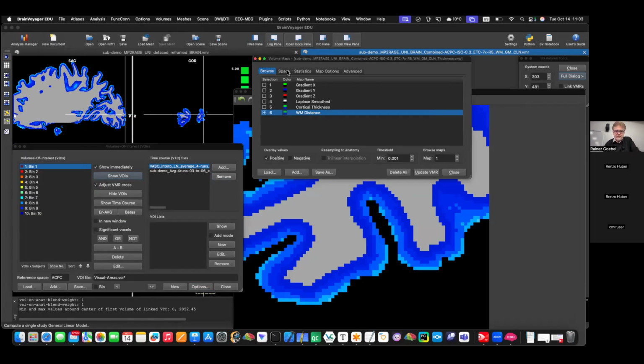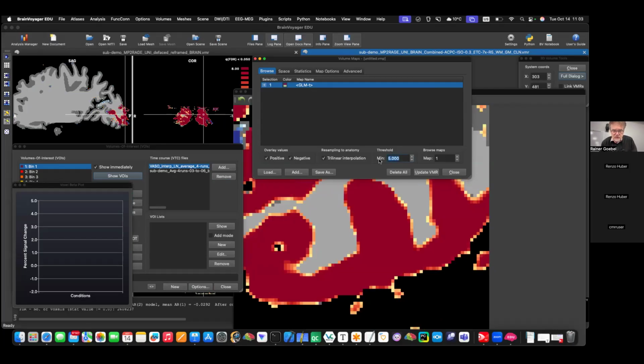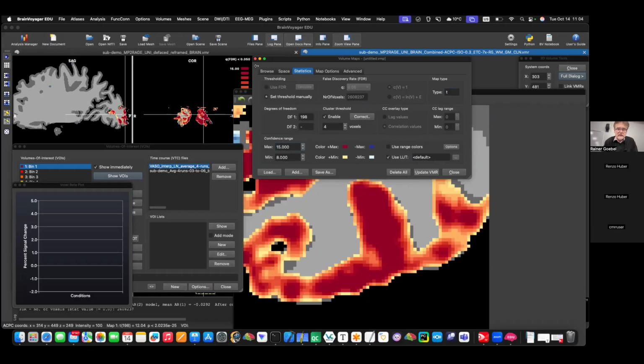And then this map here will be replaced by the p-values of our, or z-scores you can also use, percent signal change, of our checkerboard thing. So it runs now for all voxels, not just for those, then it would be much faster, but for all voxels which are in the gray matter voxels, see in blue. And it has now calculated, look how big these effects are. So, but now I will save it, so I have not to do this again. I give this here harder threshold. Even 5 is too low to just see a bit of structure. And then for coloring, I give it here a higher value. You see a bit more the T statistics.